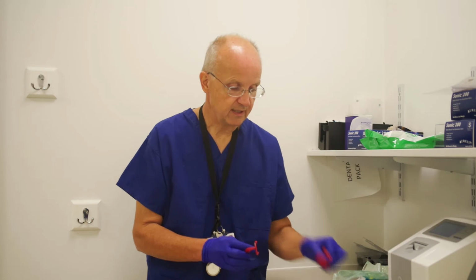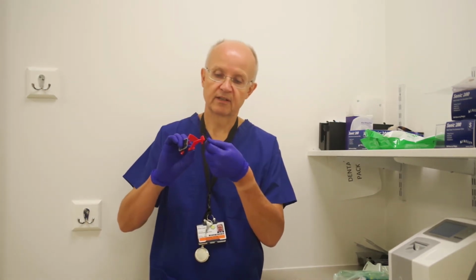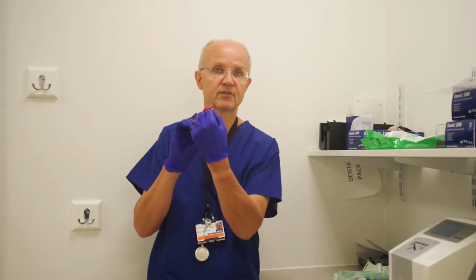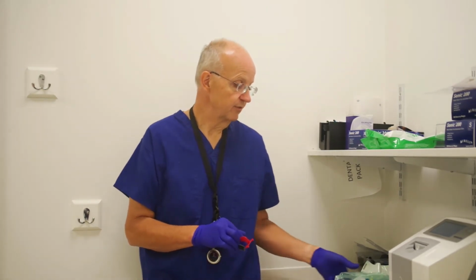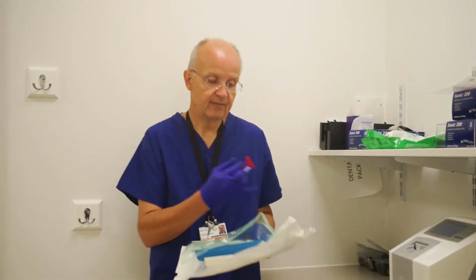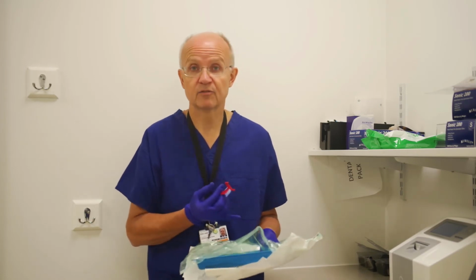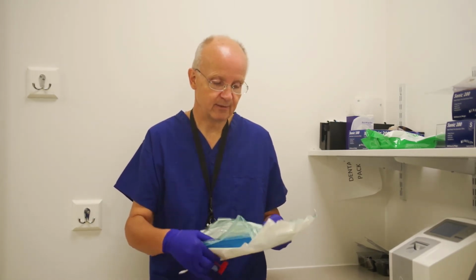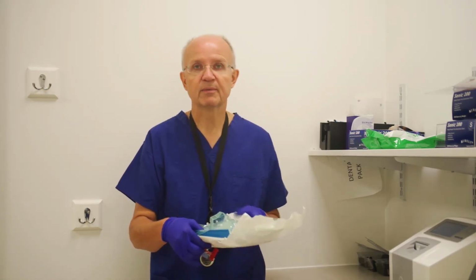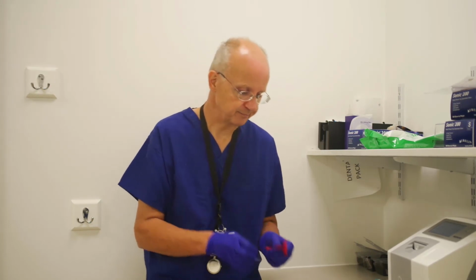So we would need a slightly different guide which has slots here which are smaller, which allows us to get the small films in. So when you get the package out of the cupboard, and before you open it, have a little look on it. See first of all what the label says. Does it say adult or paediatric? And the other thing, because I have found you can't always rely on the label, is to have a look through the plastic and just make sure that you've got the right size one before you open it up.